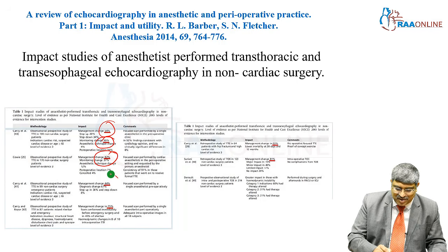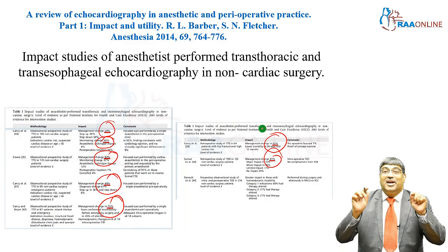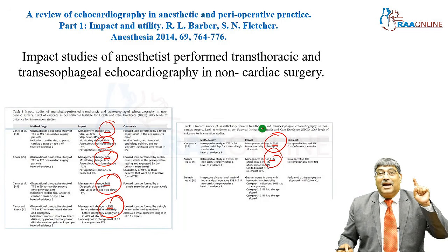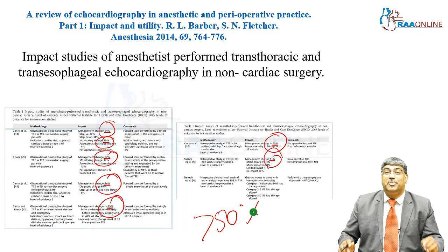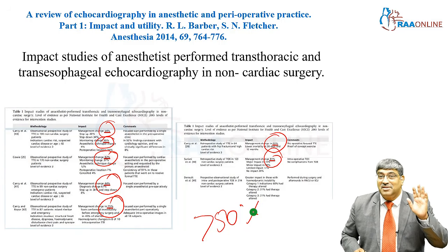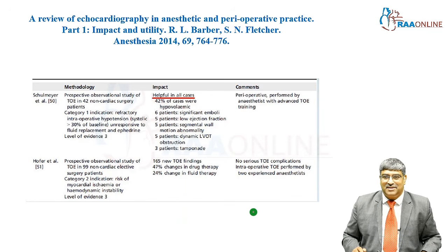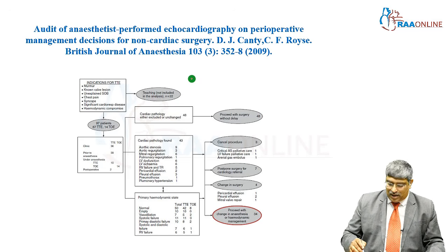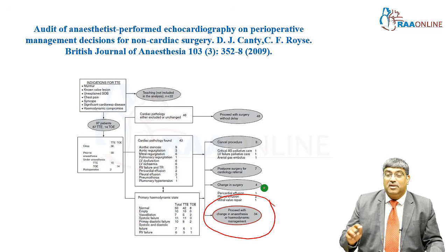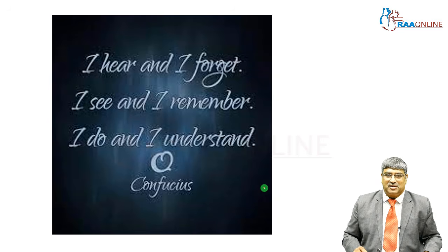You can see various percentages which are almost above 50% in most of the studies. With the knowledge of echocardiogram, your anesthetic and hemodynamic management changed in more than 50% of the cases. If the anesthetist has knowledge of echo, the hemodynamic and your anesthetic management changes. And it was helpful in all cases, and in 1/3 of the patients where the surgery was cancelled, the anesthesiologist who doesn't know echo, was given fitness and managed very successfully.